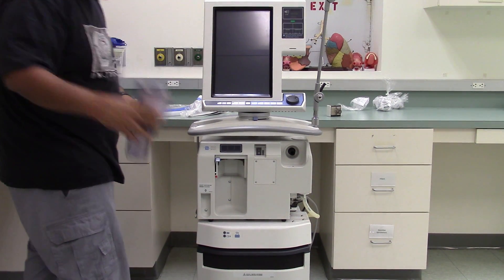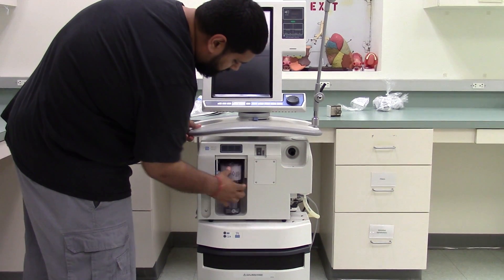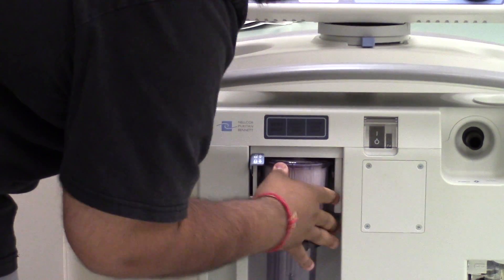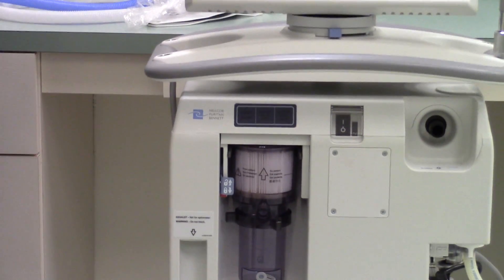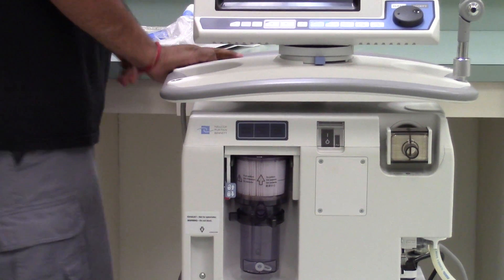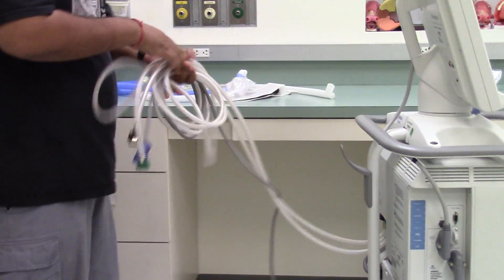This is our expiratory filter. And this is our inhalation filter.